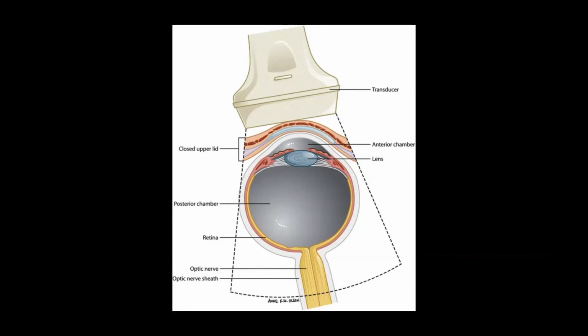We don't have the small enough footprint to be able to do everything the ophthalmologists do. And so a point-of-care typical study is going to be sagittal or transverse in the mid-axis of the eye, so over the cornea. That being said, the anterior portion of the eye, like the cornea and the lens, can attenuate some sound.